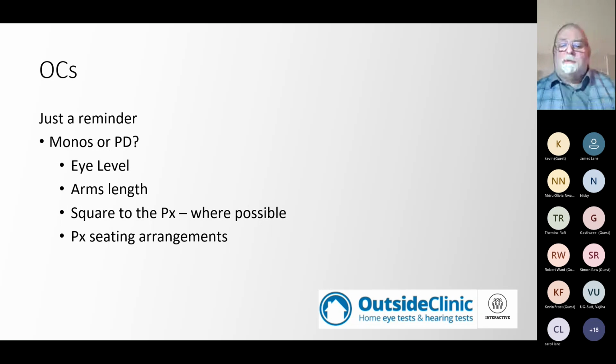So what I normally just say to the patient, again, particularly in a domiciliary setting, is I will say to the patient, OK, I'm now just going to take a couple of measurements. You stay where you are. I'm going to do the moving around. And that way the patient will relax a little bit and be in the position that you need them to be in.